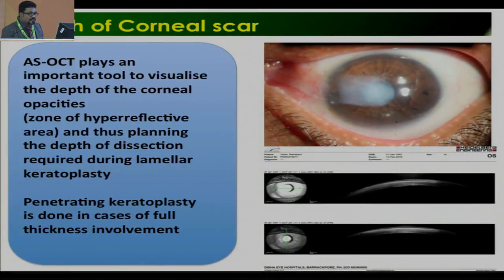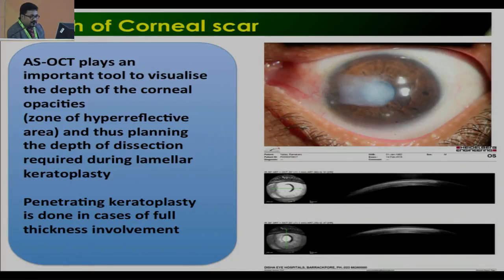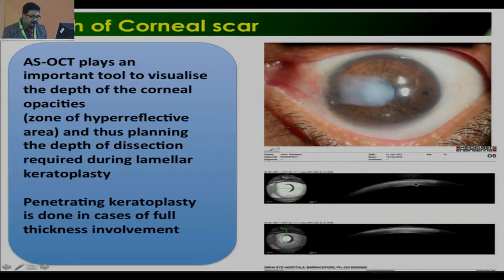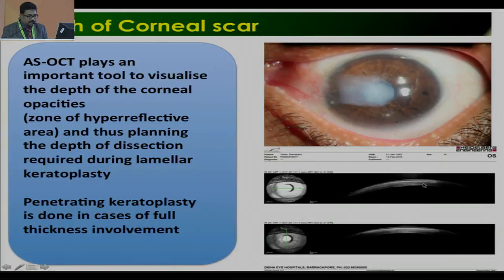What appears to be a very superficial scar — ASOCT plays an important role to visualize the depth of corneal opacities, shown as a zone of hyperreflective area. This tells us whether we need to go for lamellar or full thickness keratoplasty. In this case, even though it looked like a very superficial scar, it was involving the whole thickness of the corneal stroma, so the patient needed full thickness keratoplasty.